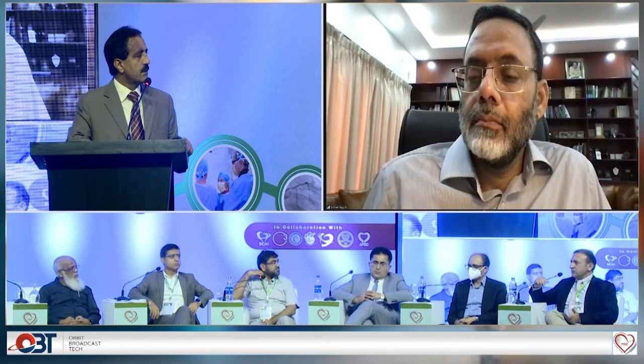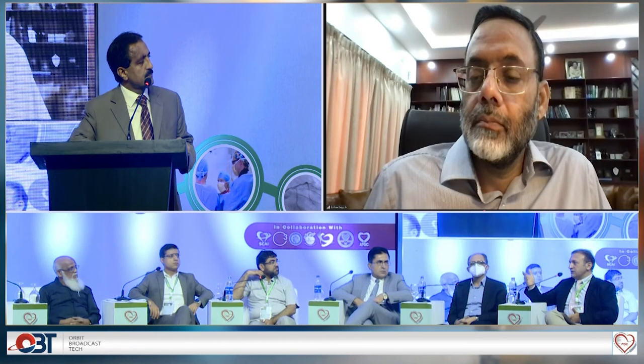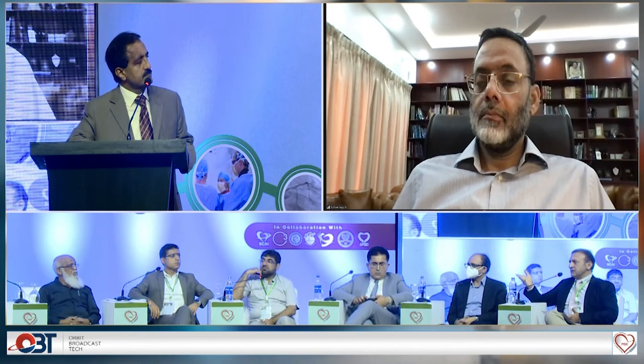That is important, to see the guide and the distal wire. Regarding how to deal with such a case, I saw one case at EuroPCR, and then I did it myself in our cath lab. We cut a balloon, mounted it on the wire, and pushed it with another balloon. It did work, and it is one of the easy ways and less expensive. Yes, I think they shared that case also.